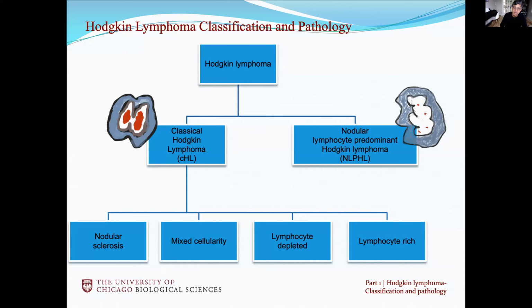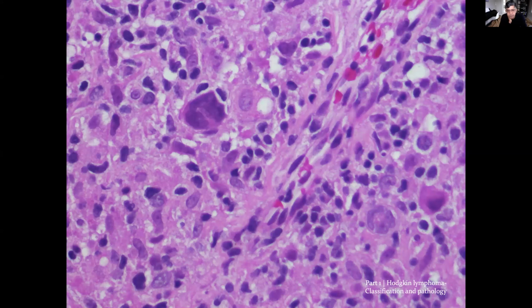So with that said, how about some pictures of some Hodgkin lymphoma? So this is your typical classical Hodgkin lymphoma. It's such a high power that you cannot appreciate architecture. So if you want really low power, the very first slide that I told you, the title slide, showed bands of sclerosis. But here you see a nice Hodgkin cell. These are histiocytes. This is blood vessels.